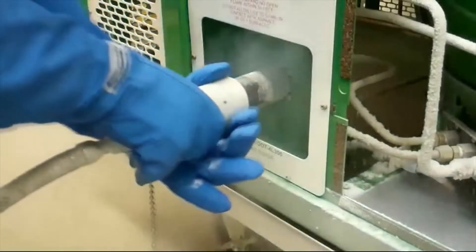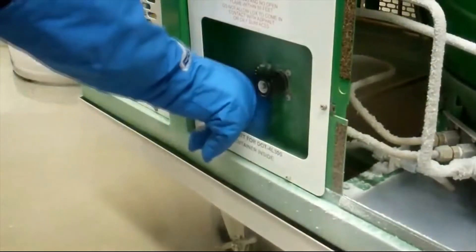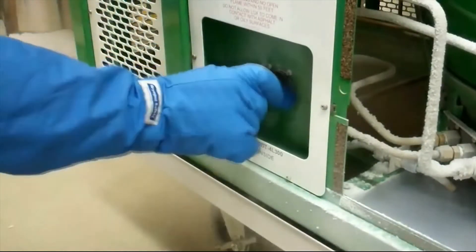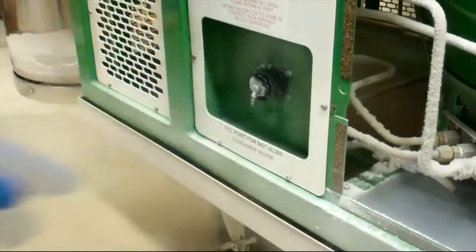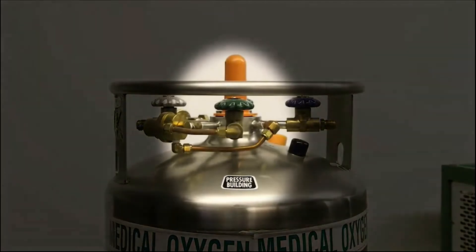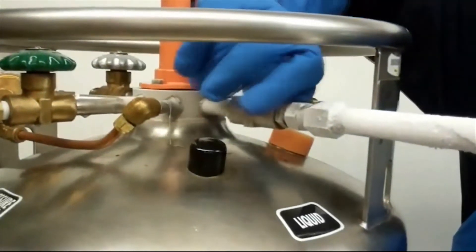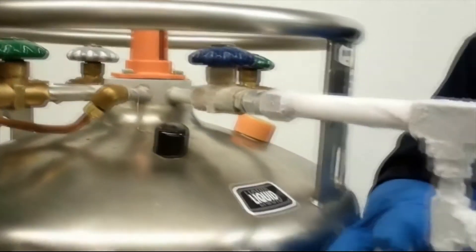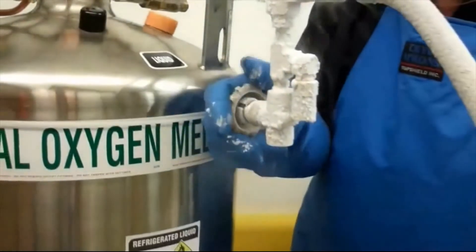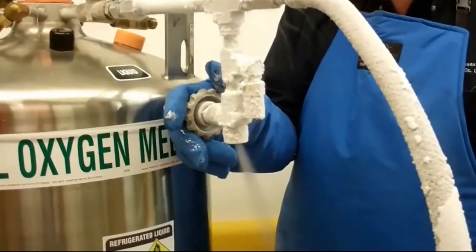To stop the flow of liquid into the MODS, remove the valve and replace the dust cover. Ensure the VGL's pressure building valve is closed. Close the VGL's liquid valve. Open the fill harness vent valve. Stay clear as some venting will occur.